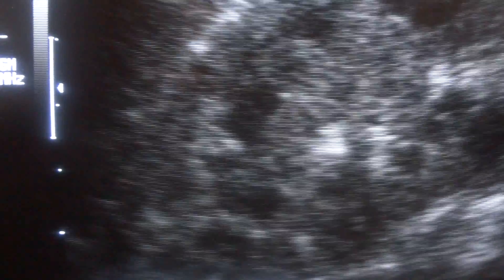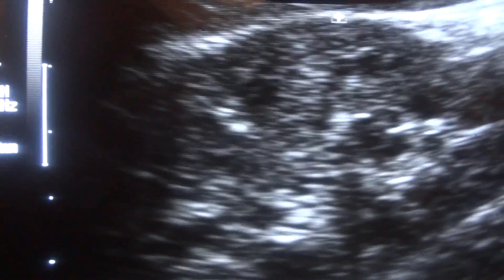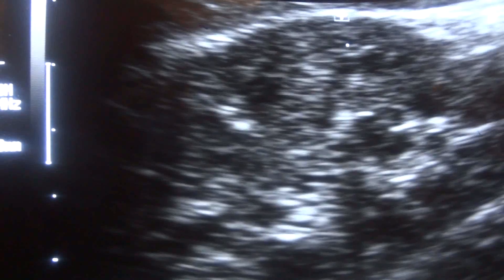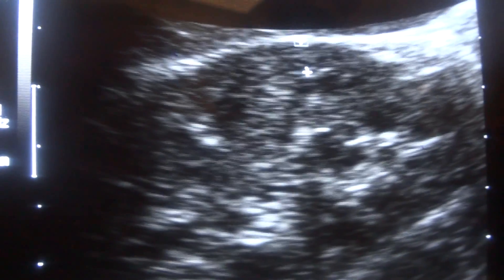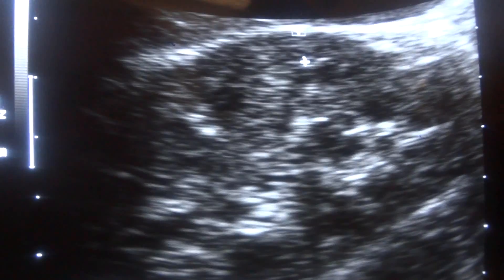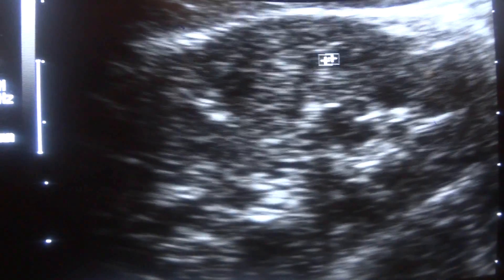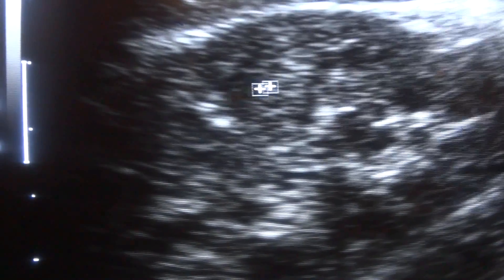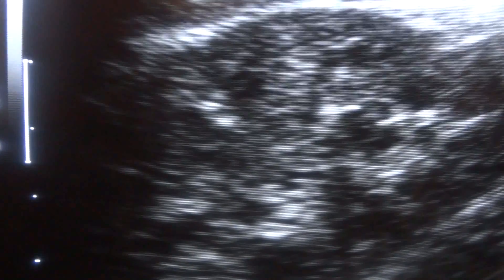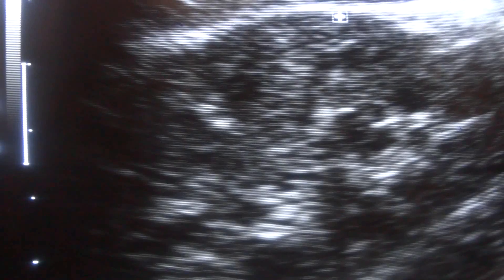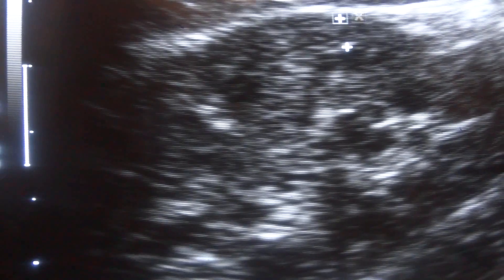So here you can confidently say that the corticomedullary distinction is intact. The normal cortical thickness can also be obtained from this view. Normal cortical thickness is 5.6mm in this patient, so it ranges between 5 to 6mm — this is within normal range. This is the pyramid, this is the pyramid — this is the medullary region.